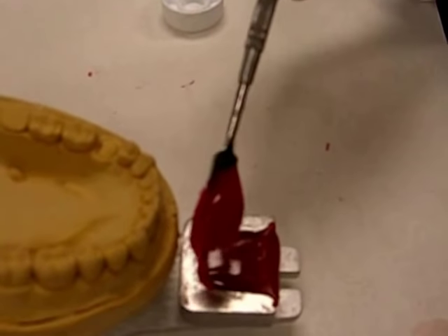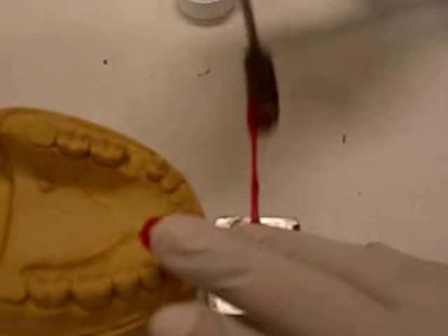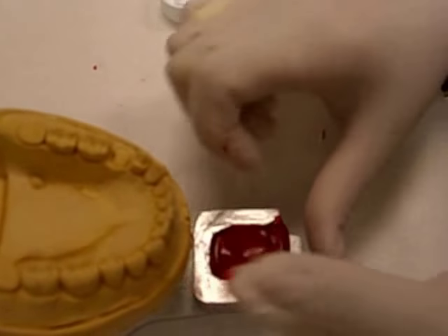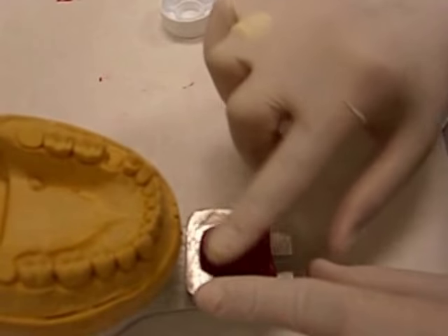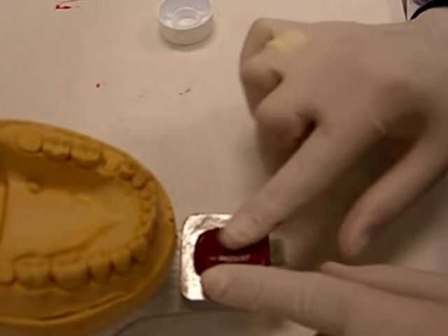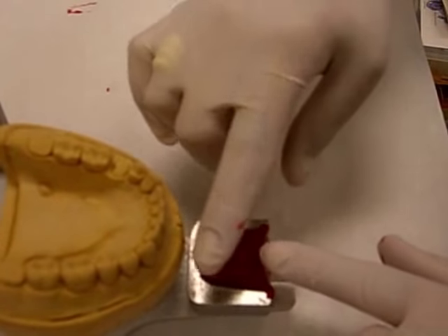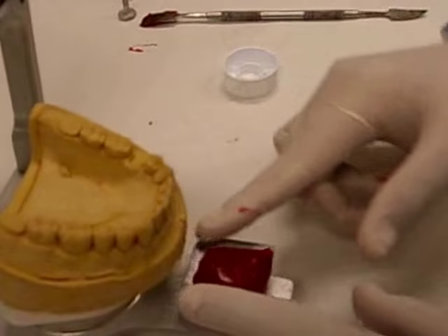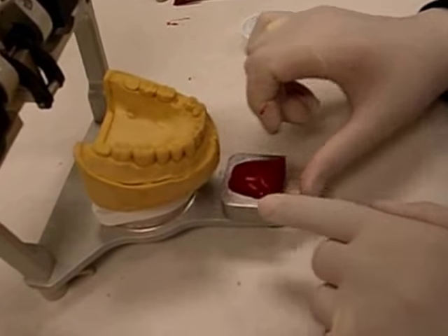It's a little messy, but if it's still on this phase, I can make sure it bonds. Have you Vaseline'd your fingers? Yes, I Vaseline'd my fingers to make it easier to handle. Note that I'm putting out a fair amount of acrylic so I make sure I have enough acrylic to record the border movements.